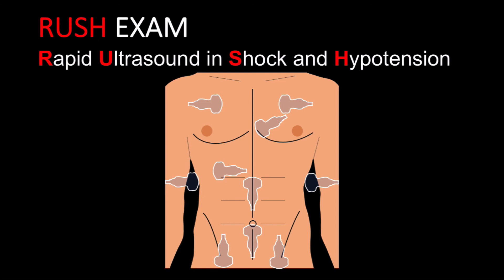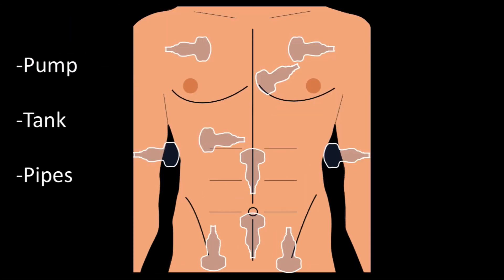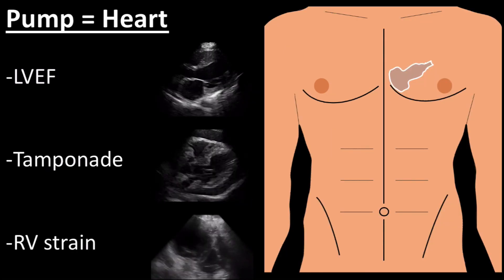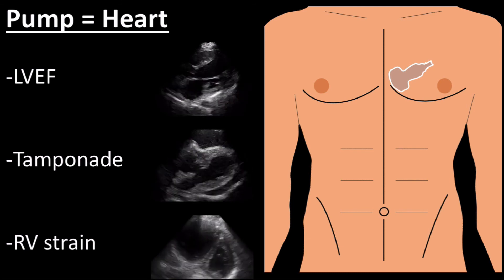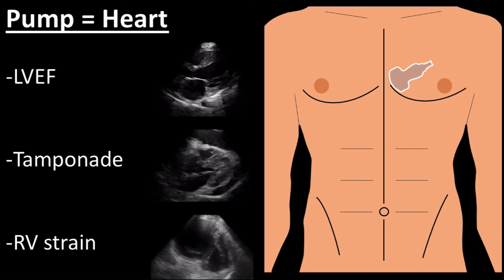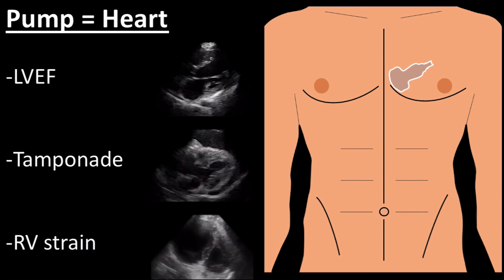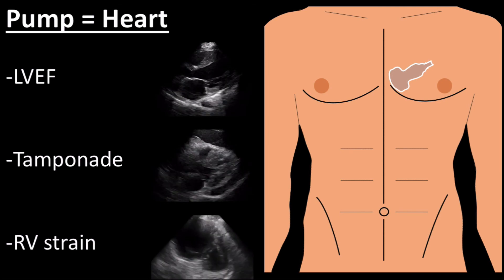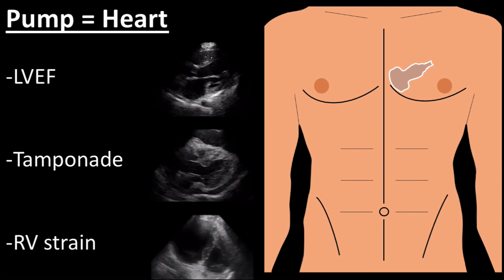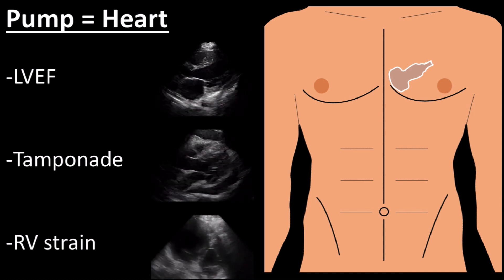As mentioned earlier, a hypotensive scan is often known as the RUSH examination — Rapid Ultrasound in Shock and Hypotension. The exam can be simplified using a physiologic perspective: the pump, the tank, and the pipes. The pump refers to obtaining high-yield views of the heart, specifically looking for pericardial effusion indicative of tamponade, assessing left ventricular ejection fraction as a measure of cardiac function, and looking at the right side of the heart for evidence of strain indicating a massive PE. Pulmonary embolism causing right heart strain was covered in June 2020 and September 2019; tamponade was covered in December 2019.